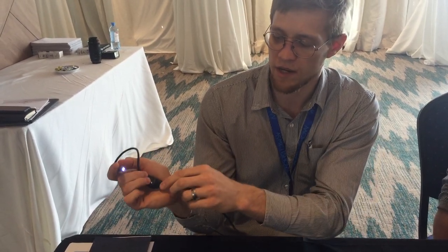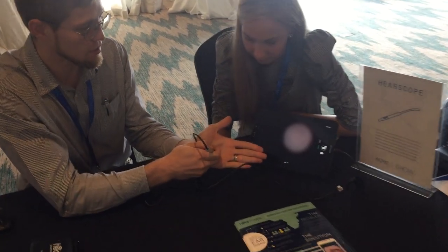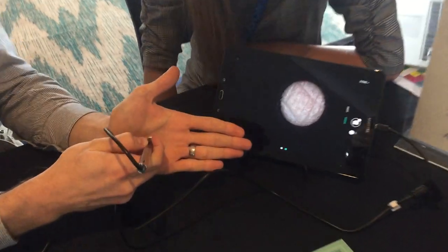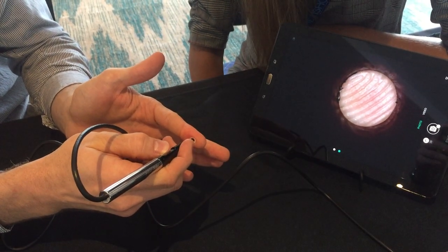You can even hold it in your hand and push that button to take a photo. Just to show you on the screen, you can see it's got a very high level of magnification — you can see the pores on my hand, the fingerprint. It's really nice.